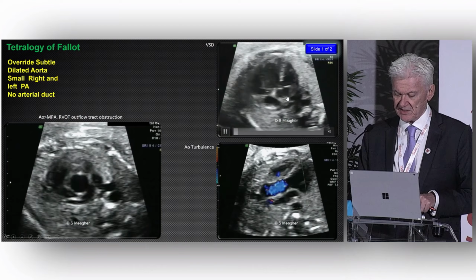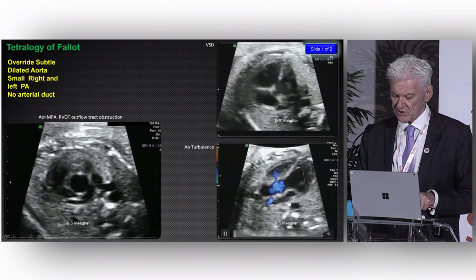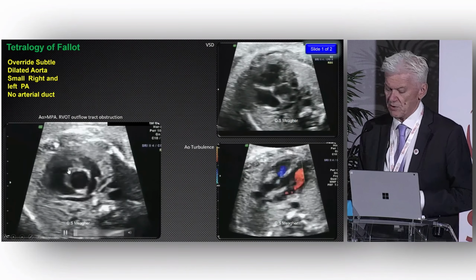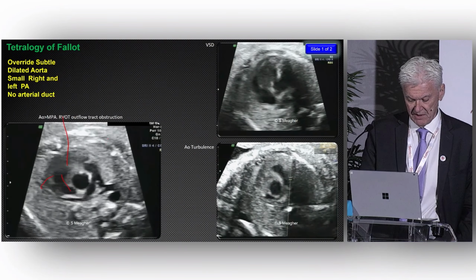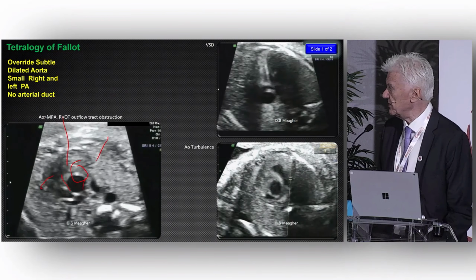And as we look at this case here, aortic override, dropout, edge enhancement, wash of color across it, turbulent flow, which I made reference to earlier on. This is the critical view. When I spoke in golden rule number 9, I'll be getting the short axis view showing the tricuspid valve, right ventricle, pulmonary valve, because it's out here is the outflow tract septum where you see your defect.